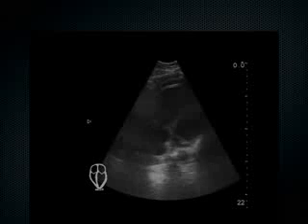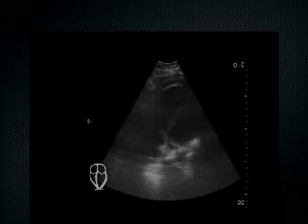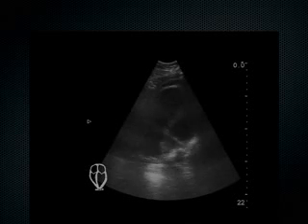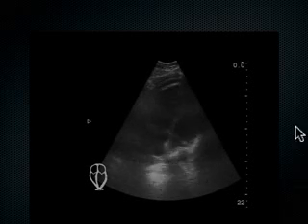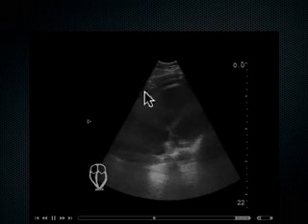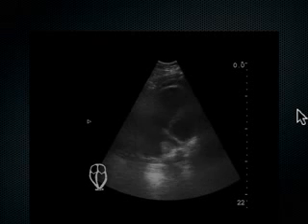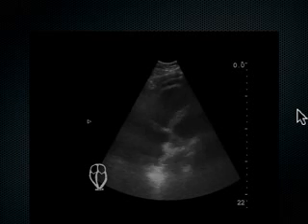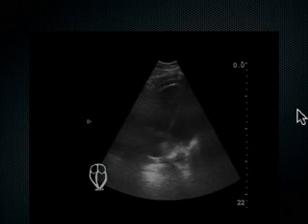This was an employee of the hospital who had an external fixation device on his leg, a 41-year-old male. He went home after orthopedic surgery. Two days later, he came back in full-blown cardiac arrest, PEA. We're doing CPR on him, and we saw his heart with no pulse. About 30% of the time, you don't feel a carotid pulse, but you actually see this amount of cardiac activity. This is called PCM, pulseless cardiac motion. It tells me the patient's still alive.